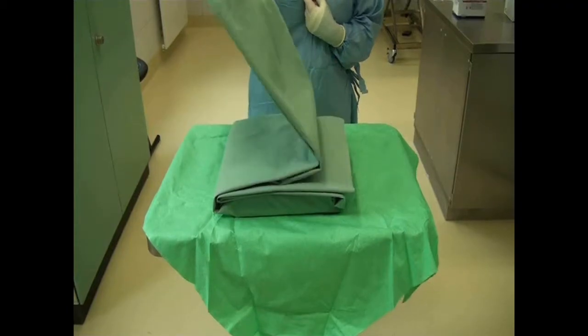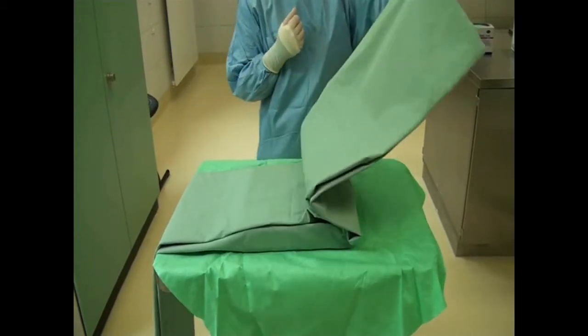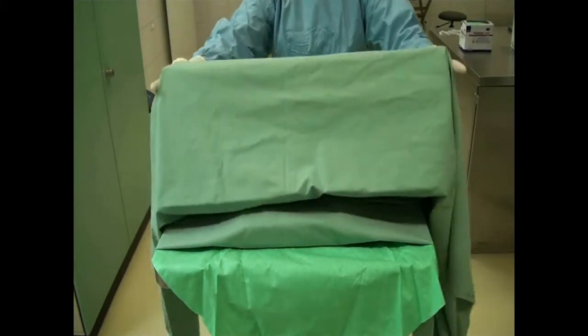A scrubbed in, gloved and gowned person can then open the inner pack. Open the sterile drape first to the sides, then towards the body and then away from the body.